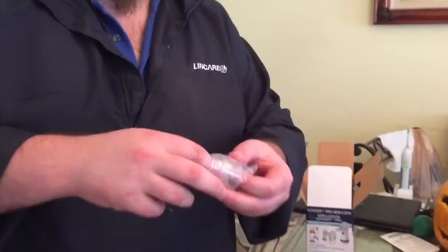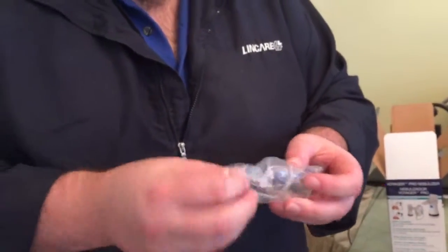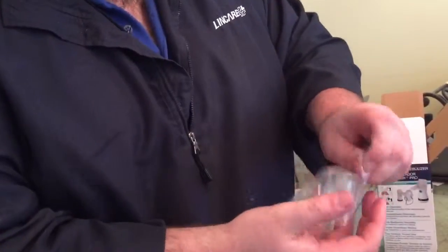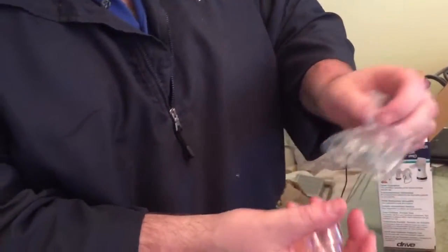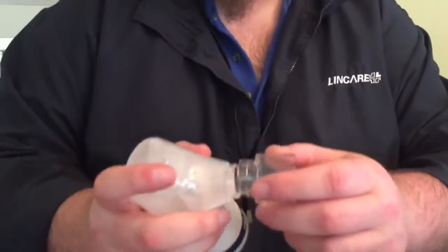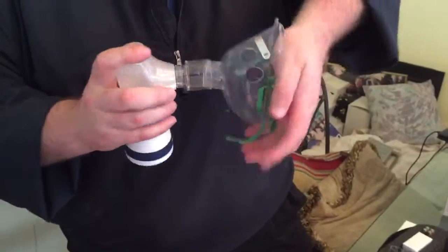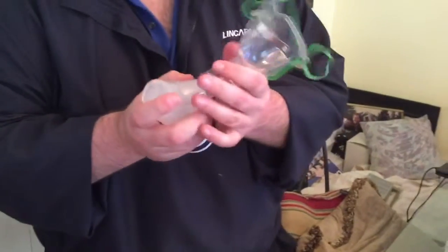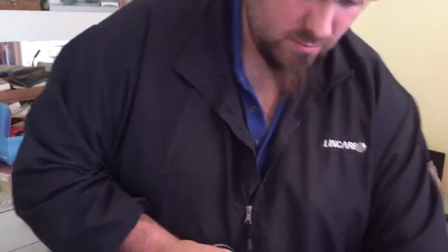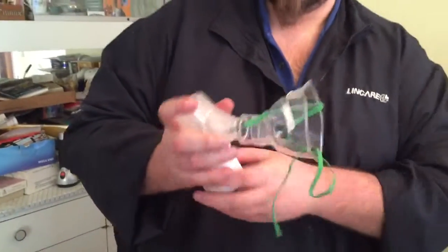This is the attachment for the masks. It goes on to the end right here where the mouthpiece goes — short end goes on just like so — and then you'll attach one of the masks to the big end, just like that.